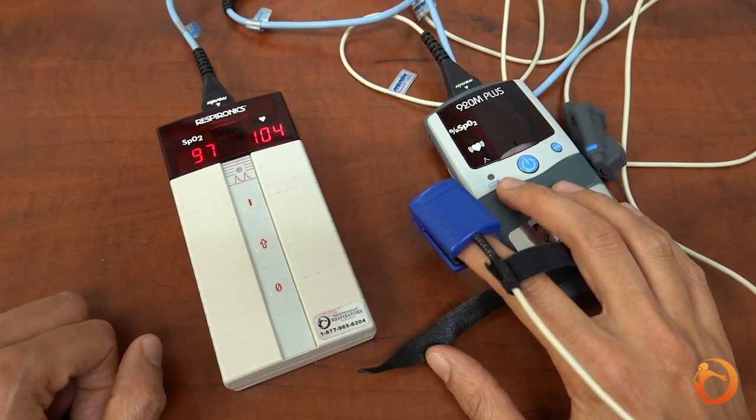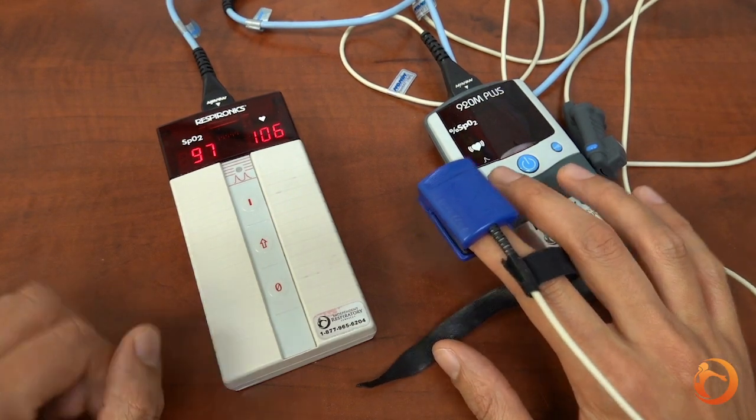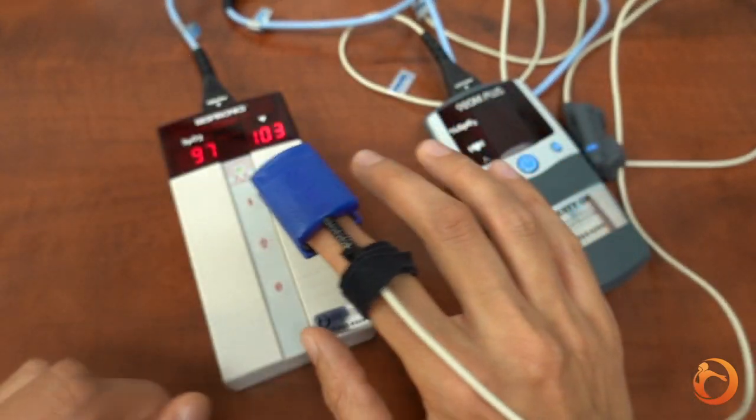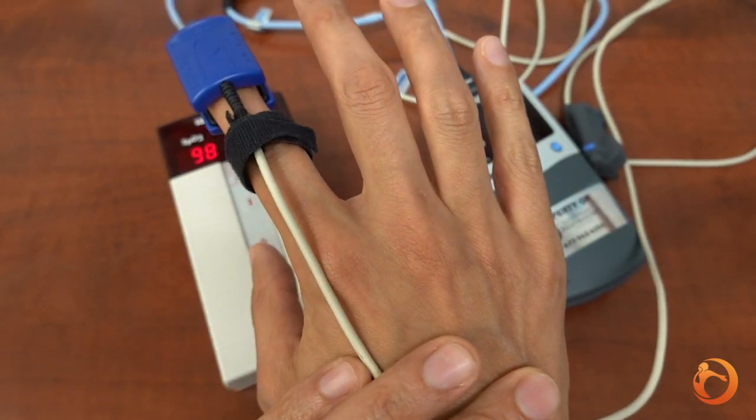Once you got a good signal, secure the probe on your finger with the velcro, making sure it allows for adequate blood flow. Secure the cable to the back of your hand with a piece of tape or band aid.